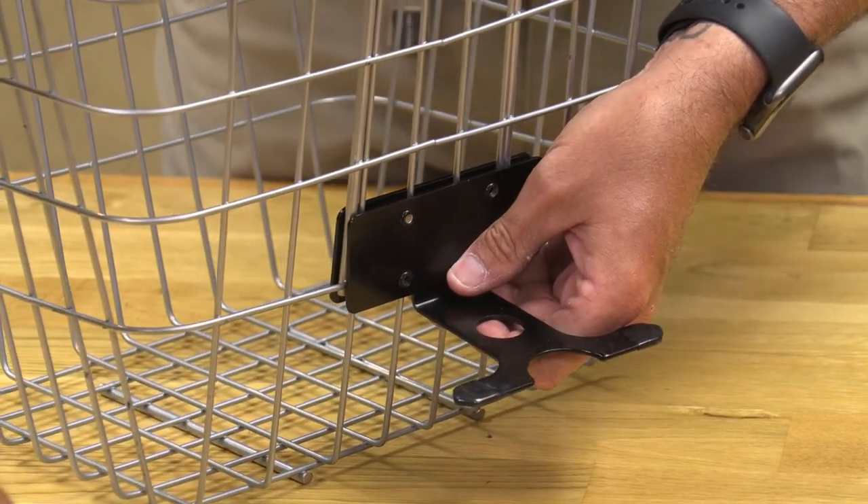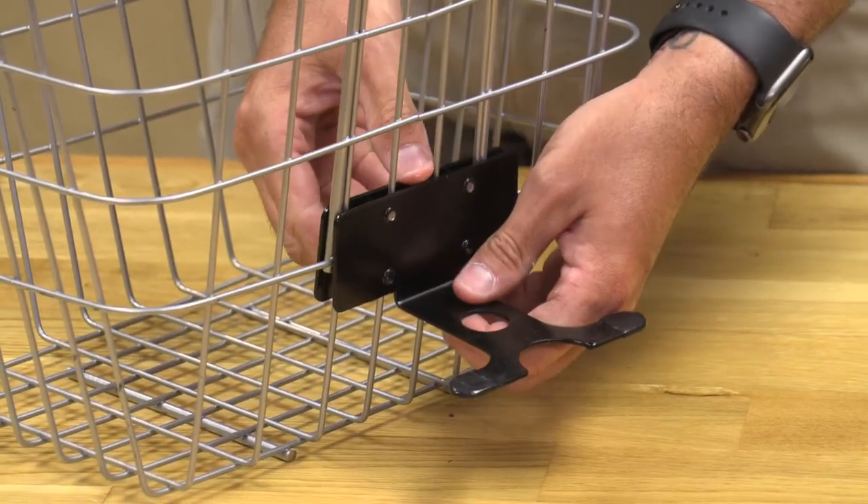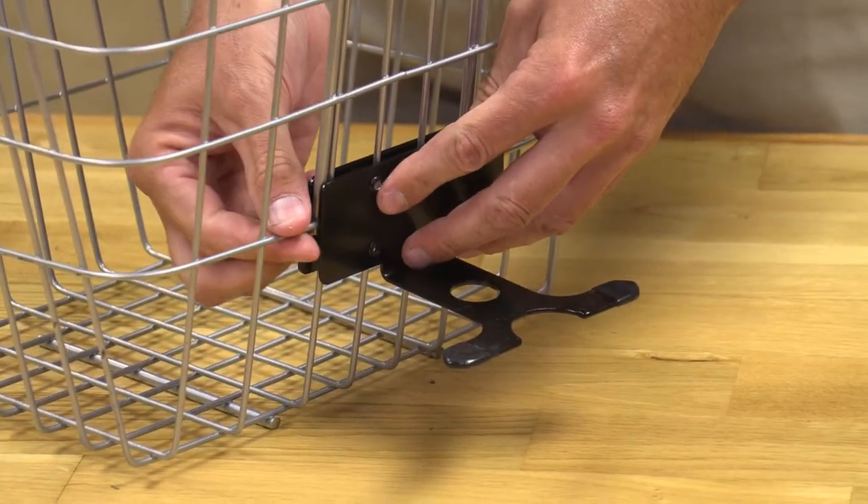I am going to hold it right in place and put in the top bolt, then put another one on the top as well. I recommend doing the top first, because once you do, you can slide it down and it sits right above this bracket there.